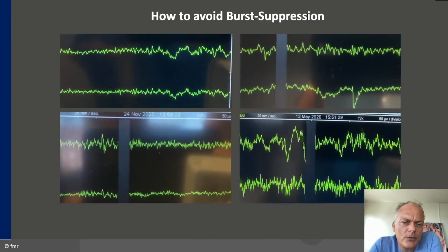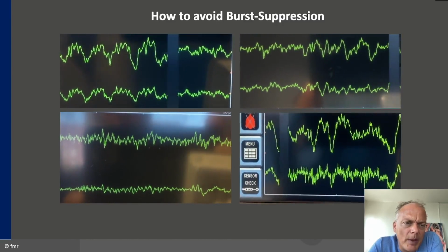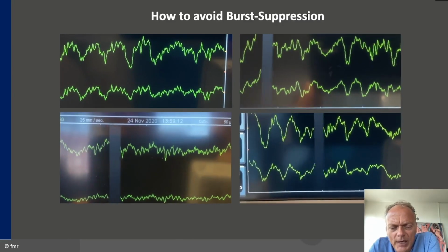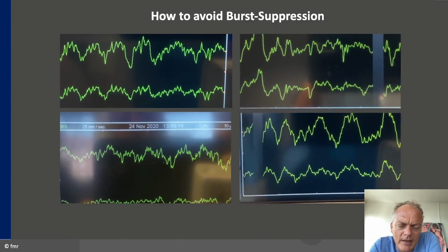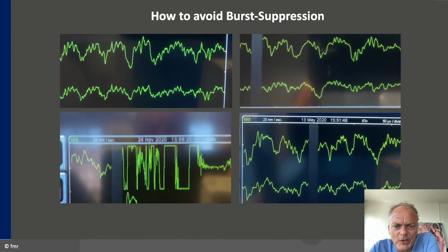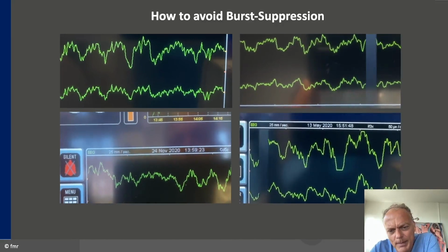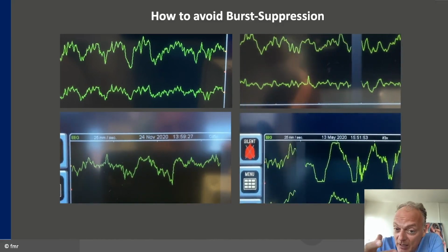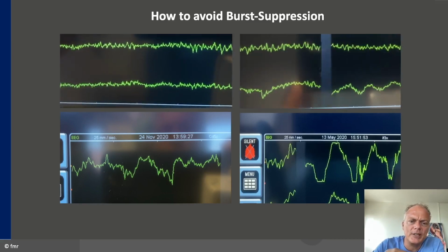You can see the changes into delta waves with alpha waves cresting on top of them, indicating in all 4 settings that at that point in time the brain is adequately disconnected. So you need to worry about the analgesic side, the autonomic nervous system side, that this is attenuated and pain is adequately taken care of. At that point the brain is disconnected. That doesn't mean it will stay disconnected if you don't continue your sedative part, but you can be fairly certain that the patient is deeply enough asleep to continue taking care of the analgesic side of the anesthesia.